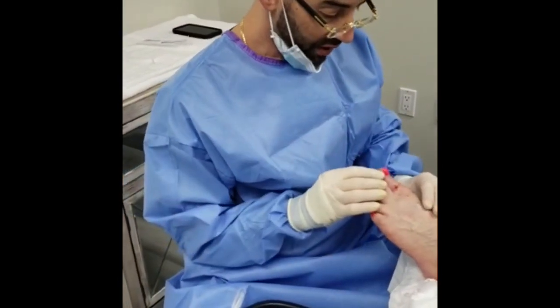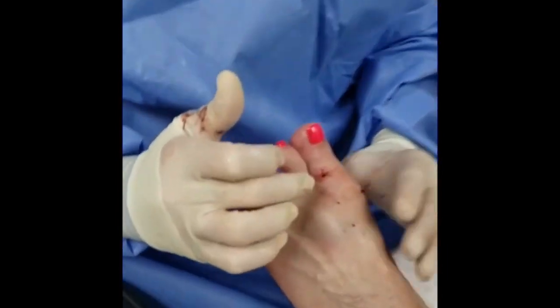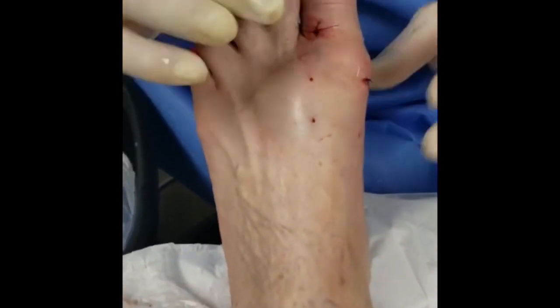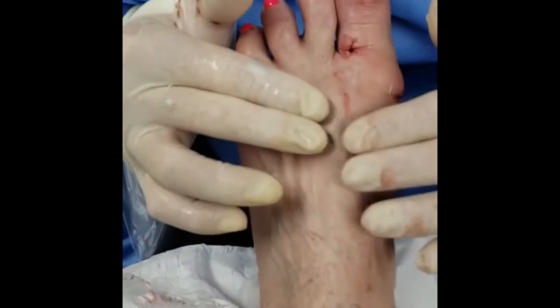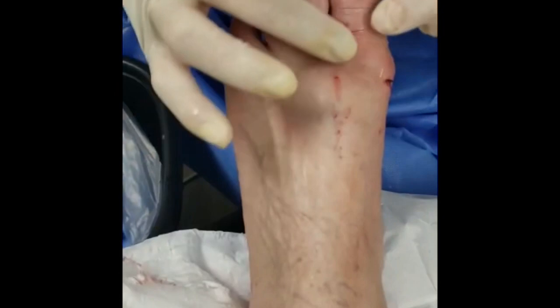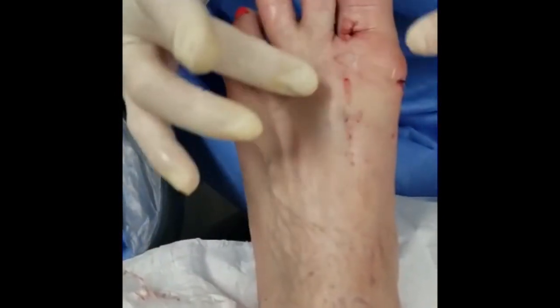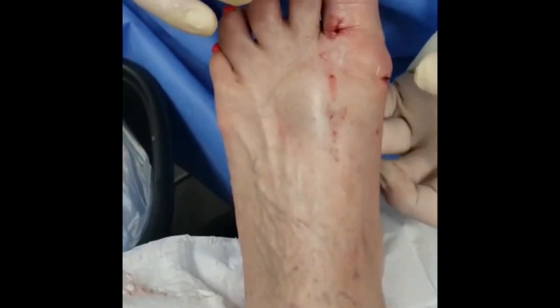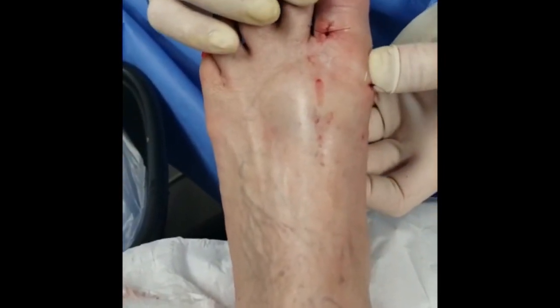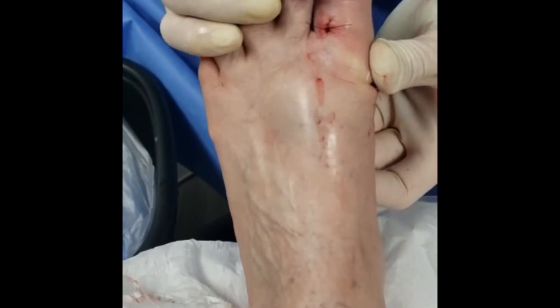Okay everyone, we're done with the procedure — the procedure was a success. You can come around here. We have one little suture. All this puffiness is actually saline that we use to flush the area. Everything is very puffy, but it's not puffy because there's bone — it's puffy because there's a lot of saline.